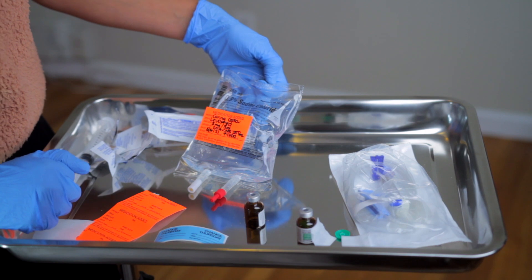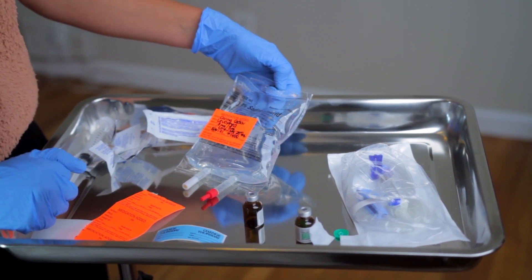Something you want to keep in mind: your levofed drip should always be administered through a central line. You want to avoid having it infused through a peripheral IV because it can cause ischemic necrosis, and it should not exceed 72 hours. In an emergency setting, it may temporarily infuse through a peripheral IV while a central line is being accessed, with MD approval.